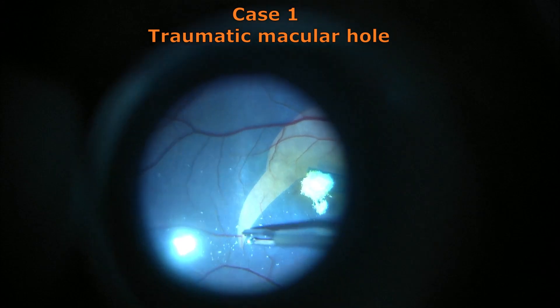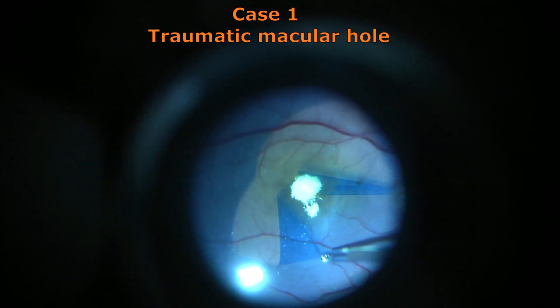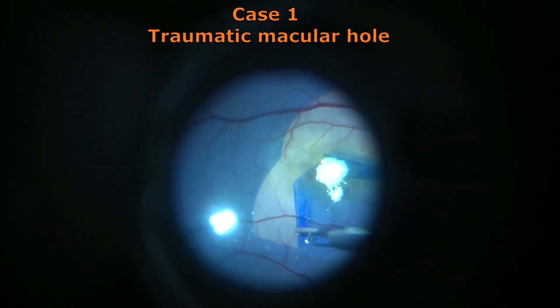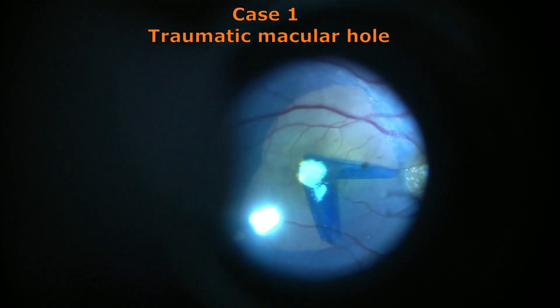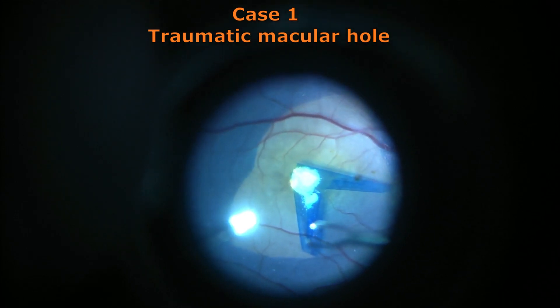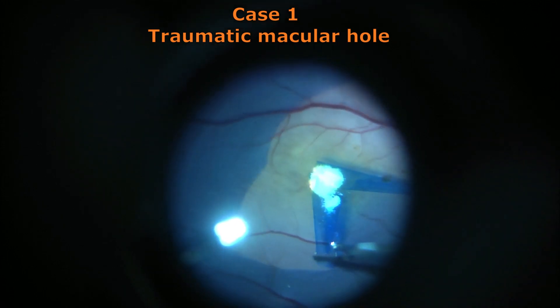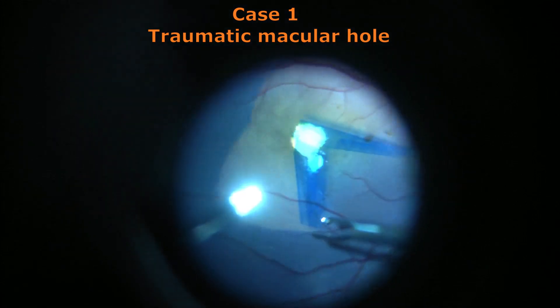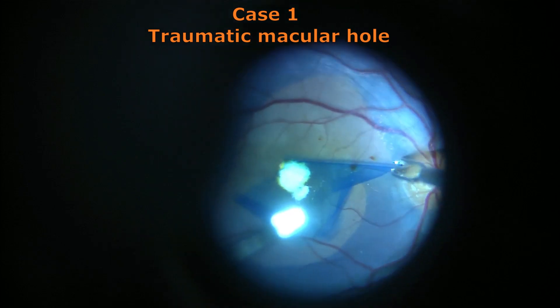One has to take care that the peeling has to be centripetal. You don't want to create any surface tangential traction to enlarge the hole. One has to always peel from the periphery towards the center of the hole so as to keep the traction centripetal, so that no tissue is being dragged towards the periphery from the hole, and this will also help in closure of the hole as seen on the table peroperatively.